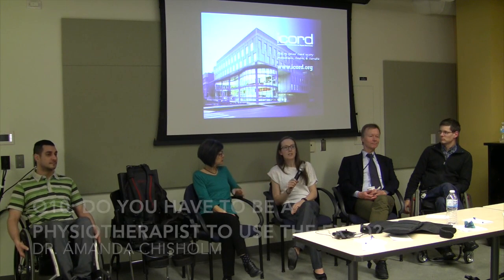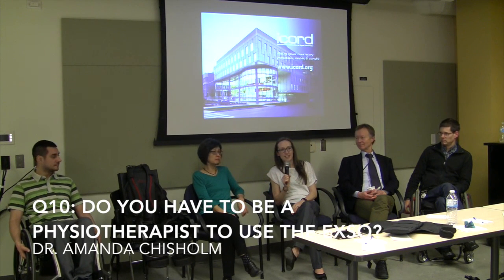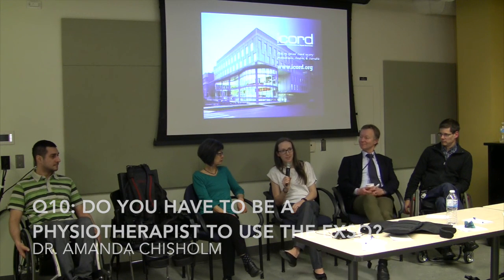Do you have to be a physiotherapist to use the EXO? For EXO, yes, they say you have to be a physiotherapist to be certified with them. That being said, I'm not a physiotherapist, but I have undergone the training, so I'm able to use it here as a research center. I wouldn't be able to use it in a clinical practice scenario. Research only. I have my training to use it at GF Strong, and you can train after your level 2. You can have other people that are not physios work with you and direct them to do it, so it doesn't always have to be a physio.